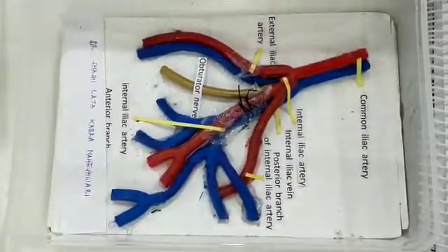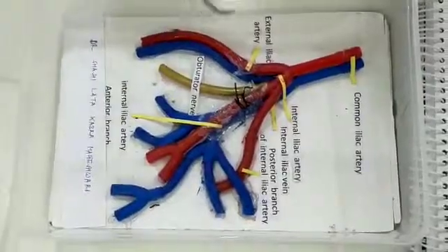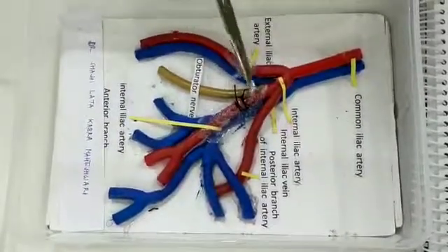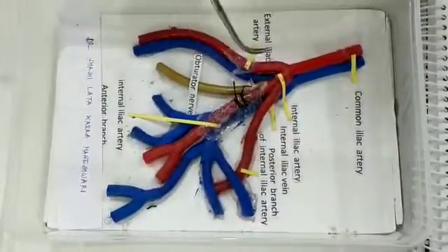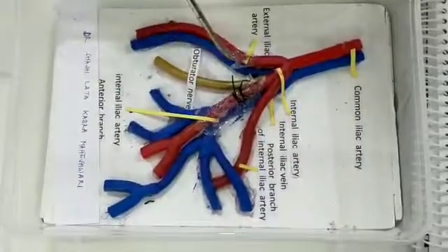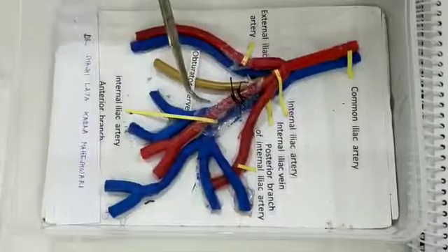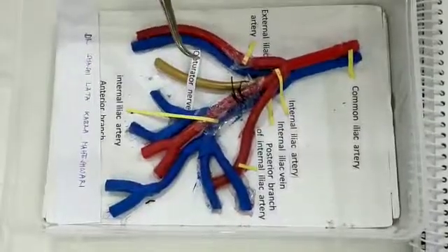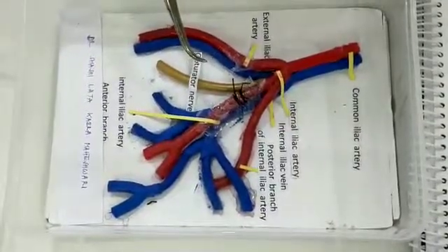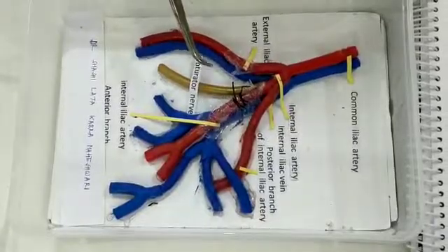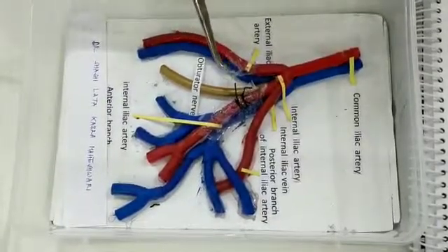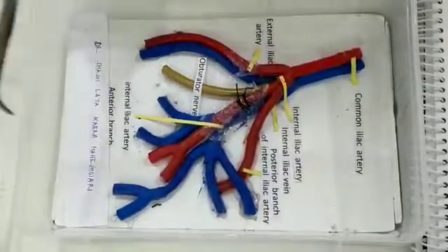Then you dissect the sheath and pass the suture from lateral to medial. The dissection should always be in longitudinal parallel direction. You pass the suture from lateral to medial always, and a single suture is made double. The loop is held and then it is converted into two different ligatures and tied like this.